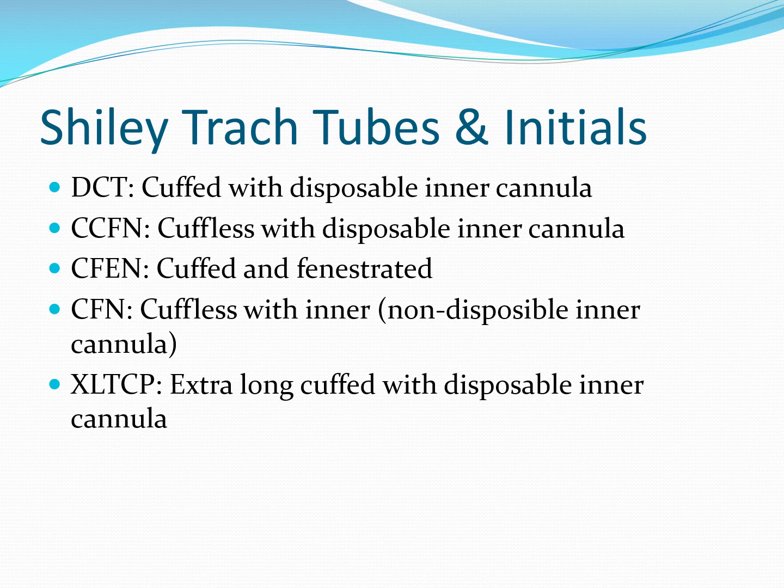So many clinicians who are relatively new to trach tubes, in particular respiratory therapists and nurses, will see the initials. For Shiley, they account for probably about 80% of the trach tubes that are sold out there. There are many more initials than what I've depicted here, but these are the most common ones, okay? Particularly near the top, DCT stands for cuffed with disposable inner cannula.